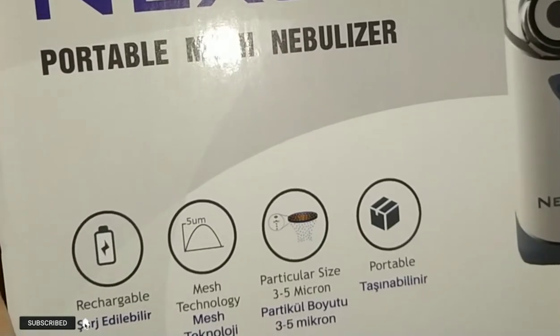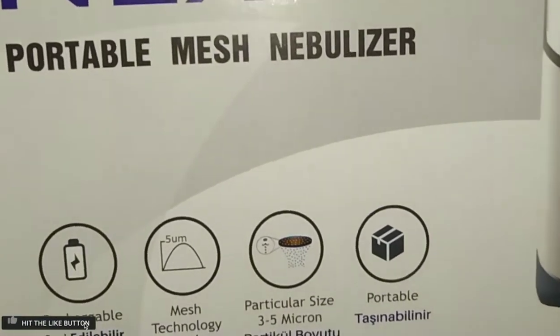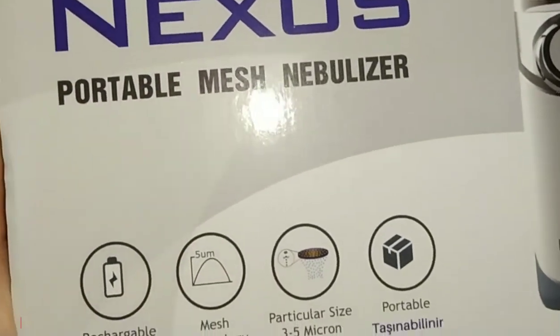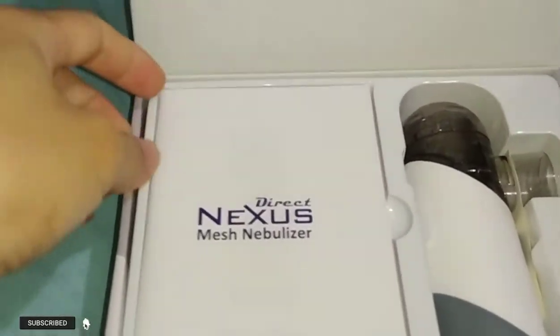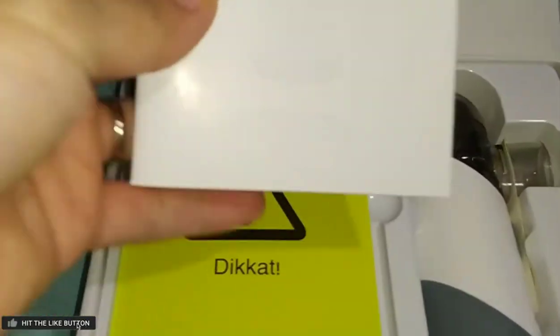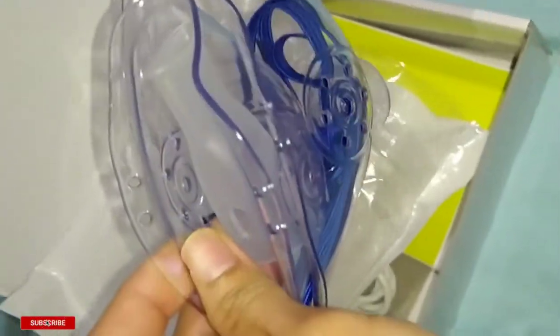Inside, it has rechargeable mesh technology, with a particle size of three to five microns. It comes with a nebulizer USB line, user manual, carry bag, adult mask, child mask, and a mouthpiece.